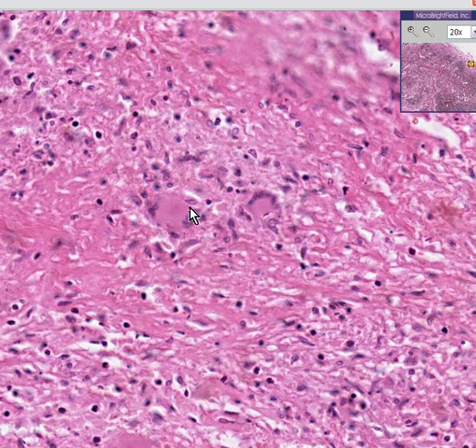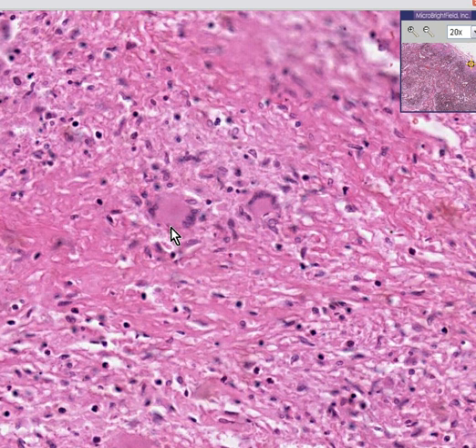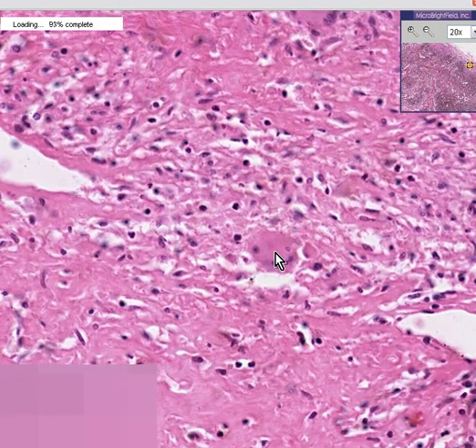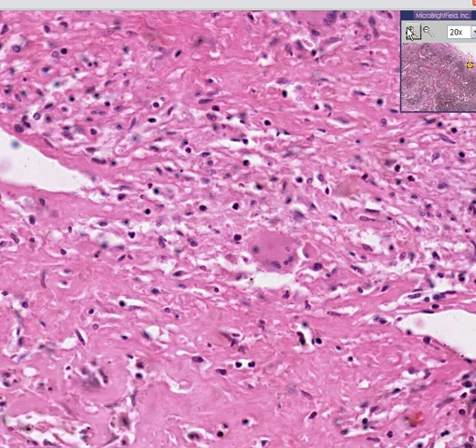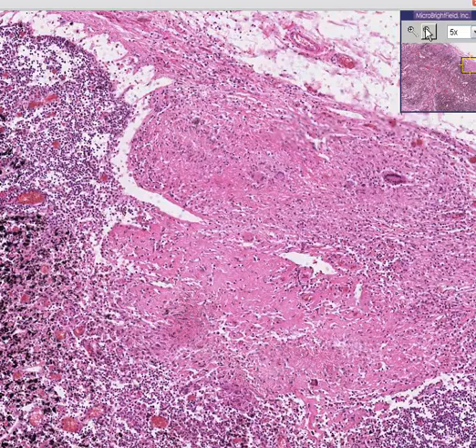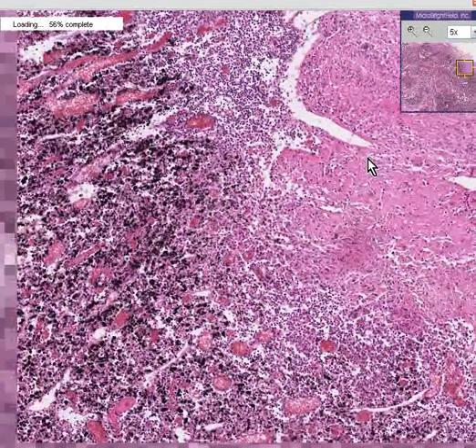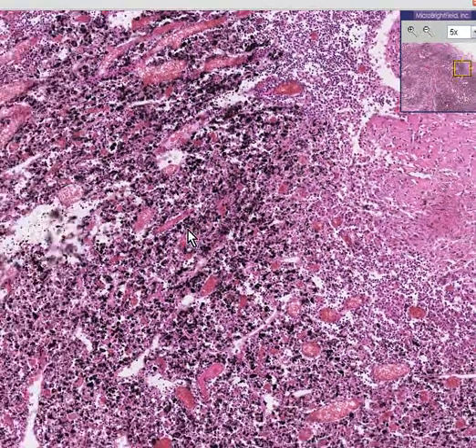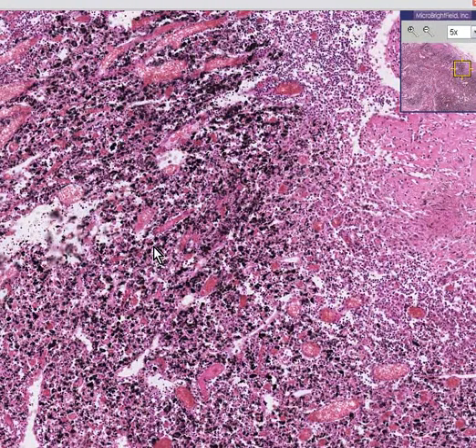You can also see multi-nucleated giant cells here, which are a coalescence of histiocytes or macrophages forming these giant cells. Here is another one. So this is tuberculosis — these are caseating granulomas within the lymph node. In addition, as an incidental finding present in practically 100% of people worldwide, there is also anthracotic pigmentation within the macrophages of the lymph node.